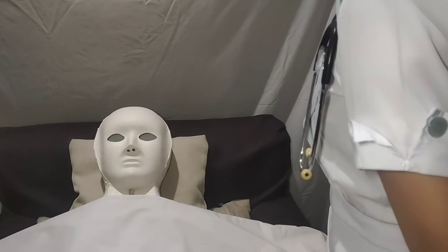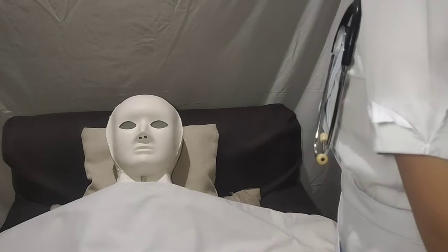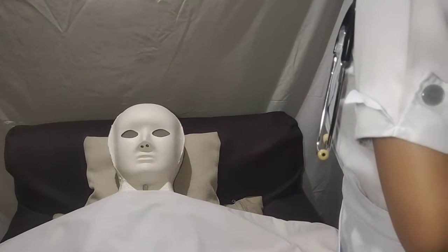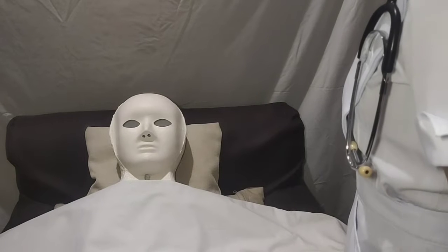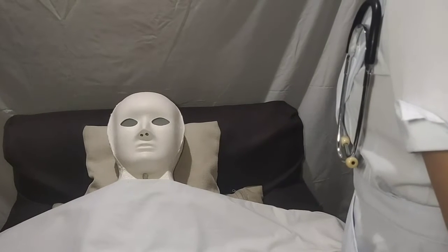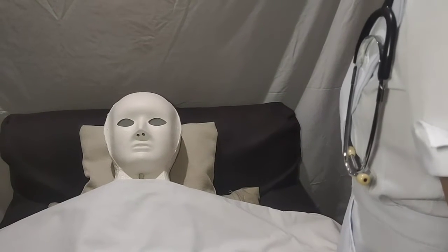Next is to explain the procedure to the patient and explain the rationale why the tube is needed. Discuss the associated discomforts that may be experienced and possible interventions that may relieve this discomfort. Answer any questions as needed. Ma'am, I am going to perform nasogastric tube insertion, which means I am going to insert a tube through your nostril and into your stomach. This serves as a way to receive the nutrition needed by your body. Since food intake through your mouth is not applicable, do you have any questions?